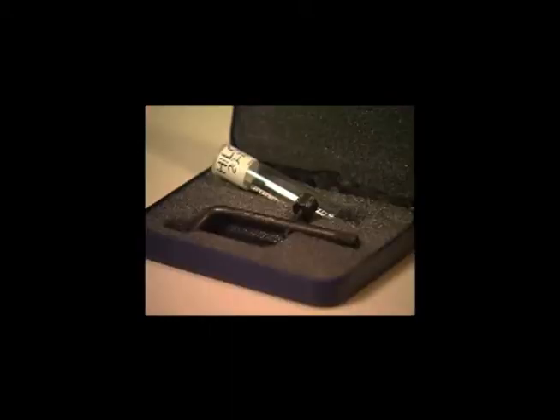Drilling out broken screws is the last measure you want to take in screw removal. Anybody who's drilled out broken screws knows that it can be a real pain in the neck, and it's not an easy job to do. We have devised a tool that virtually eliminates all the hassles in drilling out broken screws.